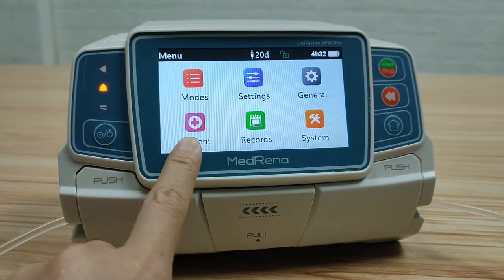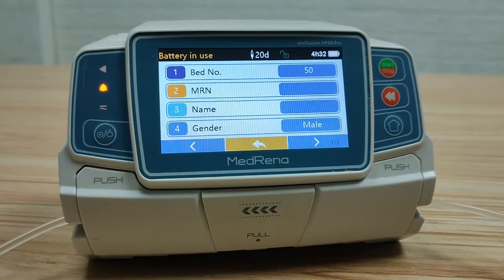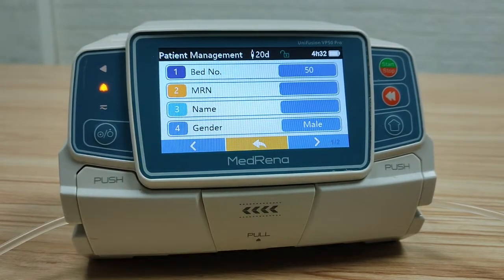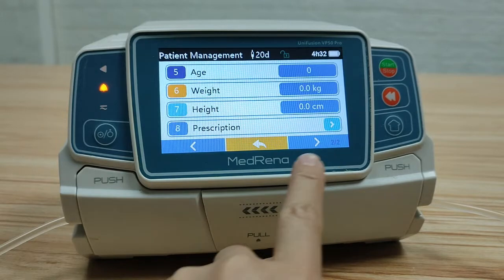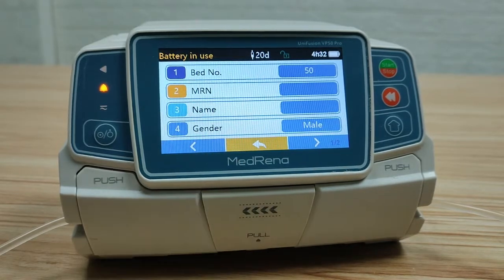Next let's look at patient. There are two pages here where you can edit the basic information about the patient.